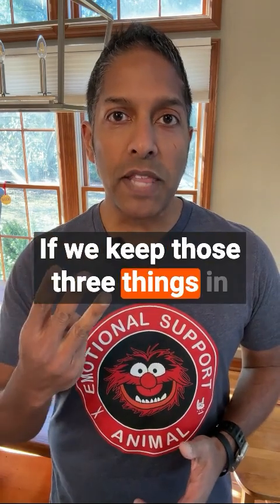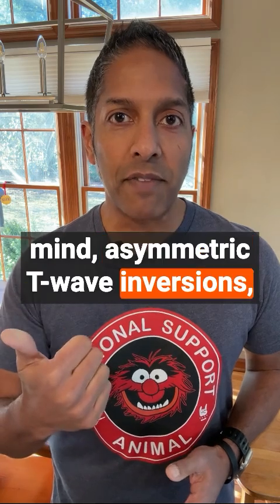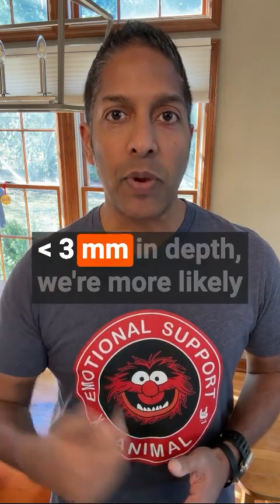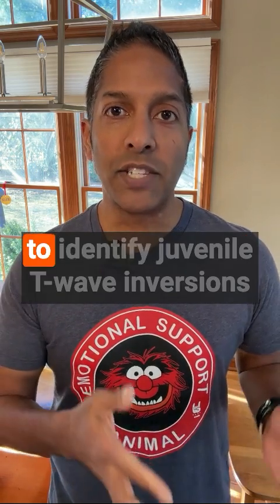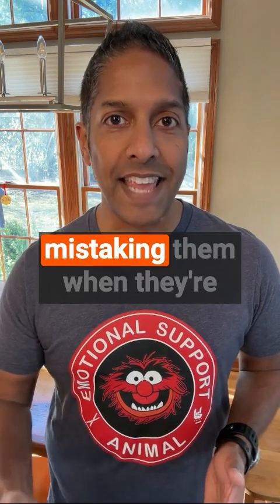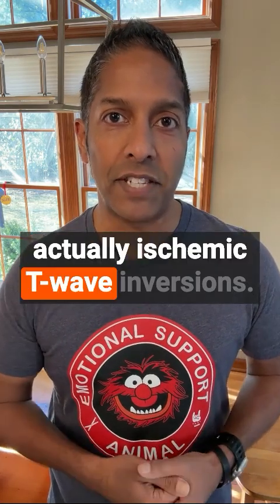If we keep those three things in mind, asymmetric T-wave inversions, typically seen in V1, 2, and 3, and less than 3 millimeters in depth, we're more likely to identify juvenile T-wave inversions when they're there, as opposed to mistaking them when they're actually ischemic T-wave inversions.